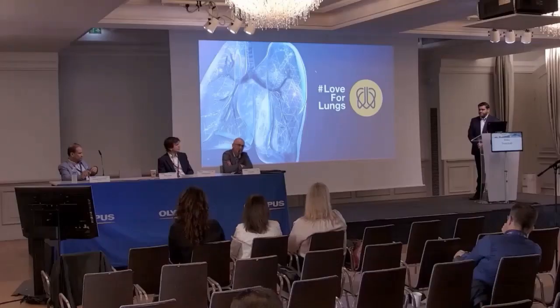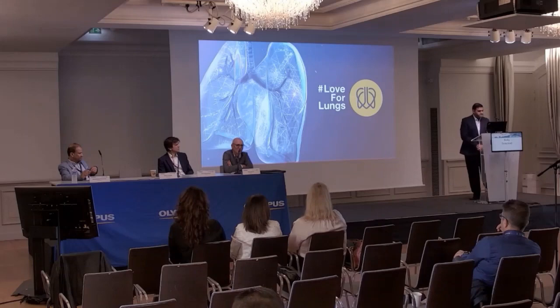So are there any questions? So again, just look to the new features Olympus added at the booth, because I think for the practical doing, you don't need it in every case, but there are cases where you really have additional information before you run into a disaster. And also what you showed, when it starts already bleeding, it's quite helpful to see where the bleeding is coming from. So RDI, a new option to have maybe a safe outcome for you and for your patients when it starts bleeding. Thanks a lot.